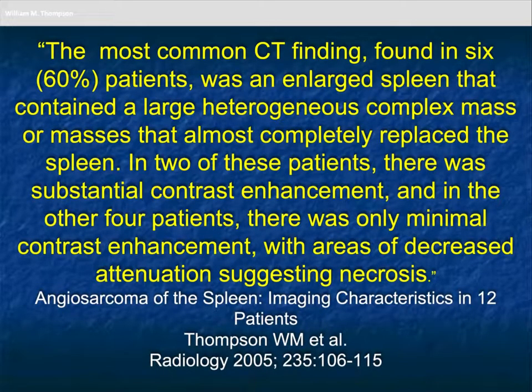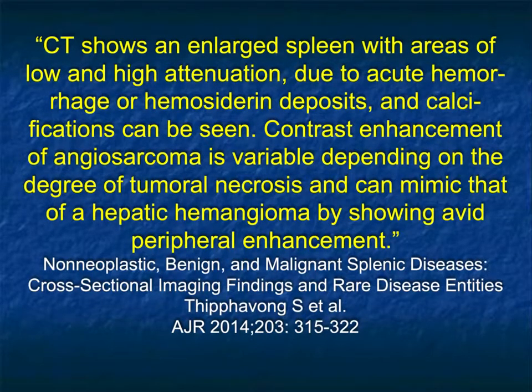This article by Thompson from way back when spoke about the various enhancement patterns, but in this article, the techniques were different. Fast acquisition, you're going to see that vascularity. Again, a very, very important diagnosis to consider, but something that's exceedingly rare.